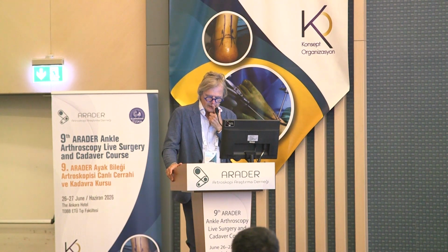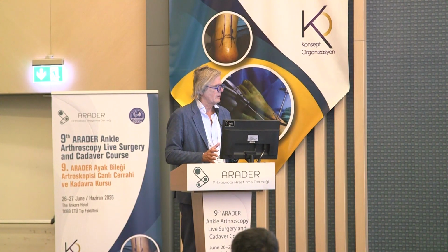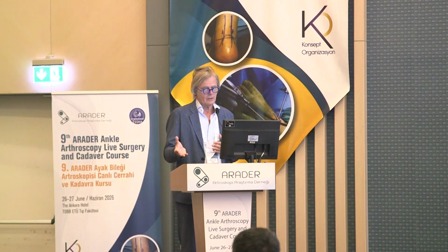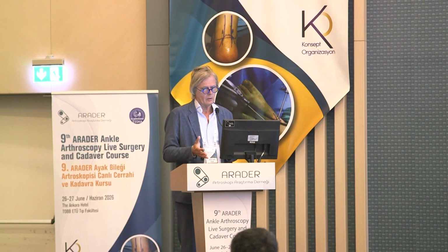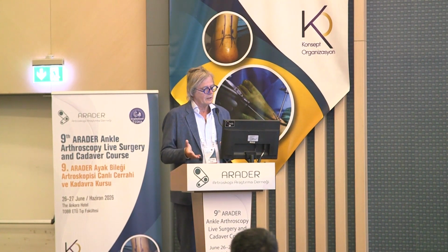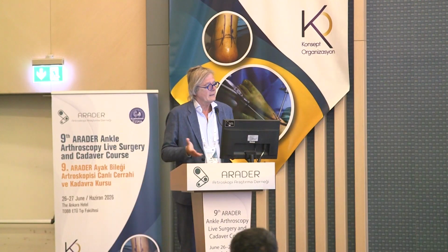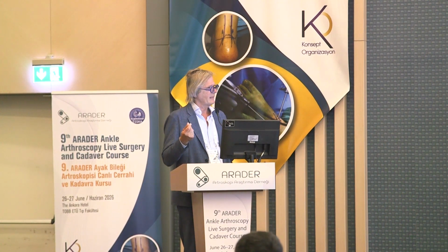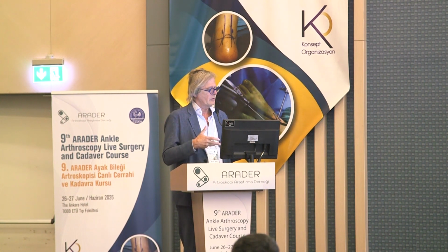The way I look at it is that I'm not dogmatic that I have to treat everything by arthroscopy. So I look at the patient, I see what the diagnosis is, and then I decide what is better in my hands for this patient. Can I do it arthroscopically better, faster, with the same result, or can I better do it open? For example, the lift drill fill fix, which I showed, I do it open. I can do it arthroscopically, but I cannot do the same quality of repair as I do with open surgery. So then I prefer to do it open.